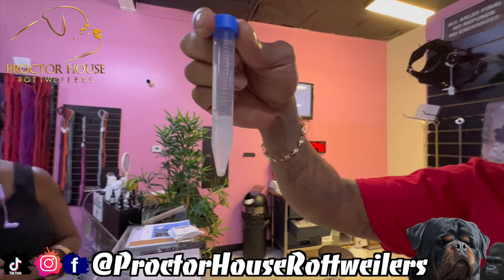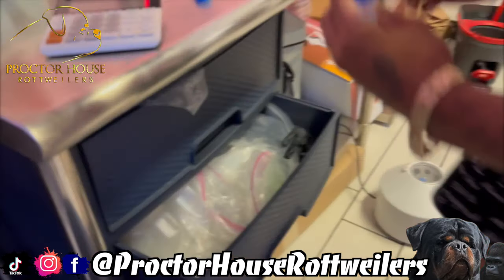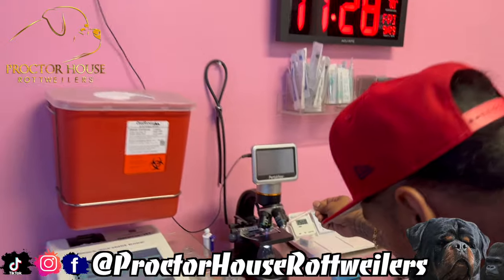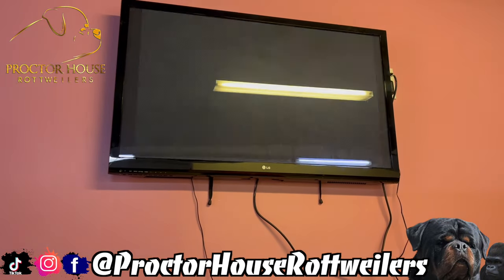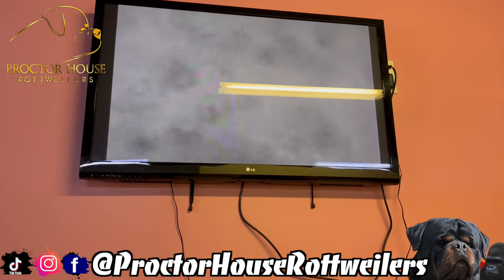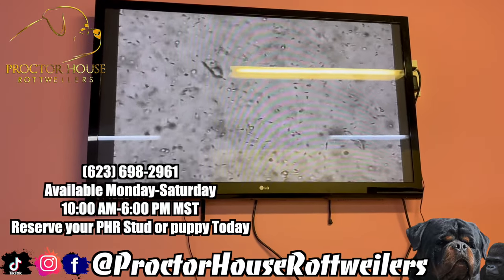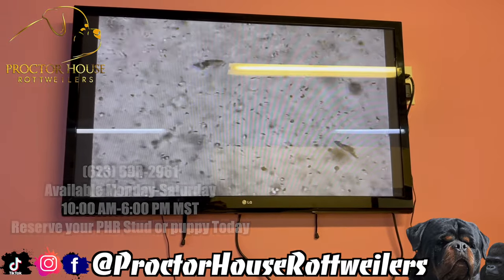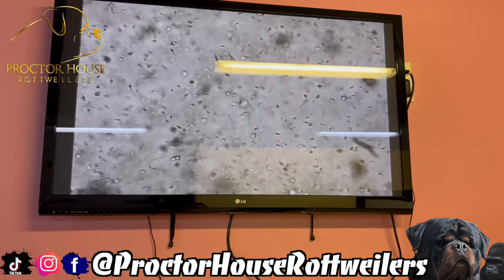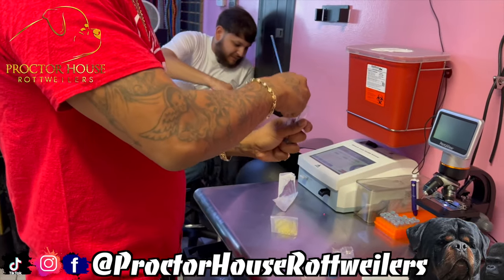Now that we got the semen spun down, you can see at the very bottom of the centrifuge tube is the pellet of semen — look at that right there. We're going to put the semen under the microscope one more time since we got it more concentrated. And as you guys can see, that semen is moving a whole lot more, and it's warmed up as well. The semen is good and ready to go.